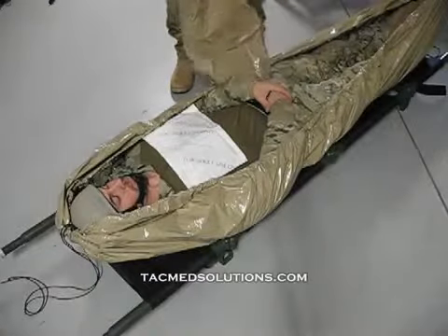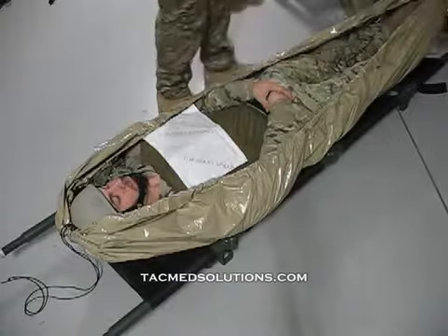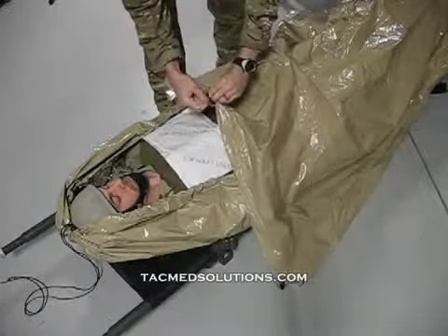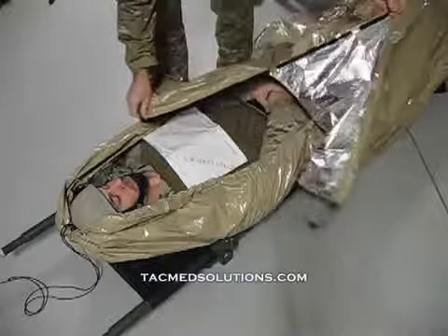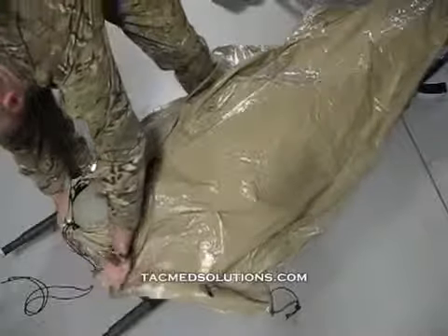The top cover is laid over the casualty and is large enough to be used independently or as part of the system. To secure the blanket to the casualty, a portion is opened and wrapped around the casualty's head. It is then reconnected underneath the head.